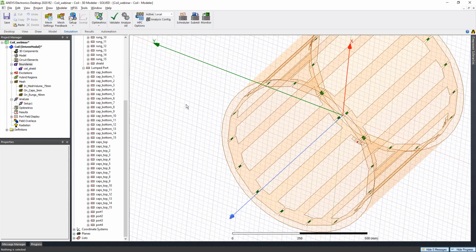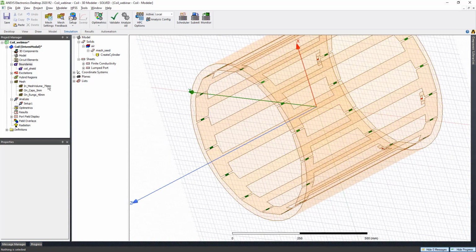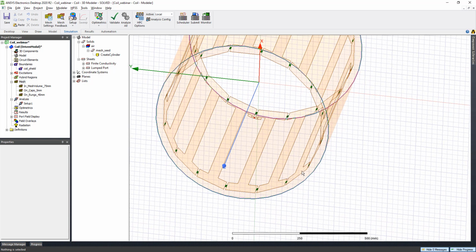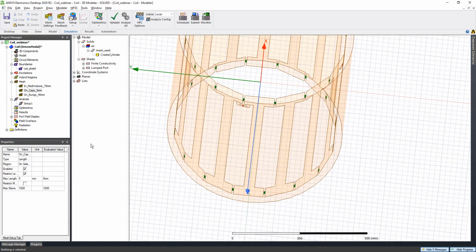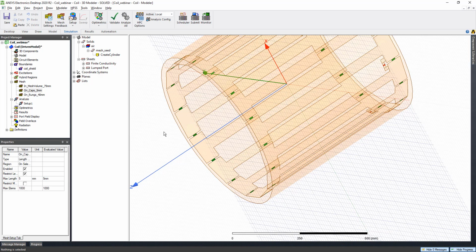Okay, another setup we have here is an airbox. Here I'm having multiple different mesh sizes because I'm trying to reduce the time for the simulation. With larger structures, I just give a larger mesh size. With smaller structures, I just have a smaller mesh size. You are always welcome to change this to anything that you like or to have a higher accuracy.